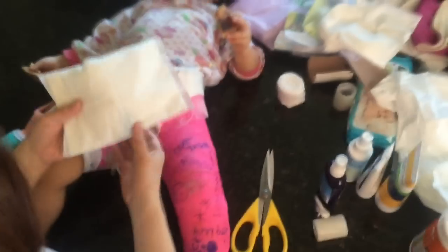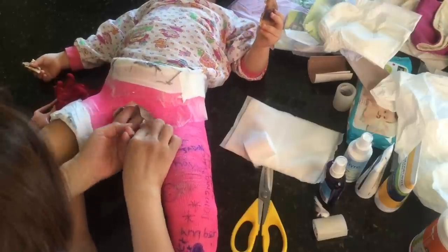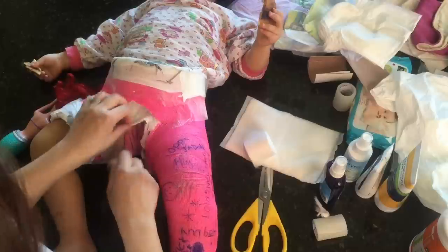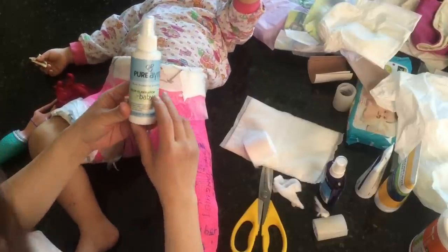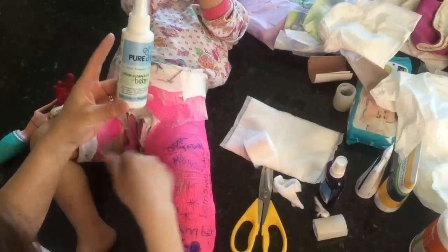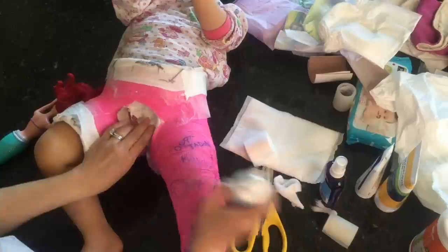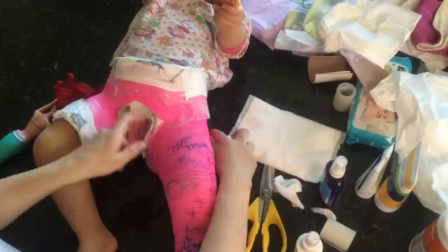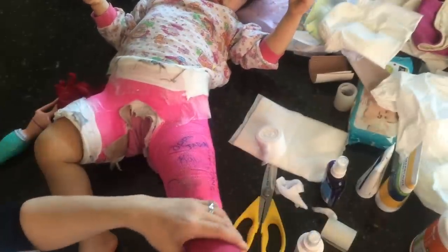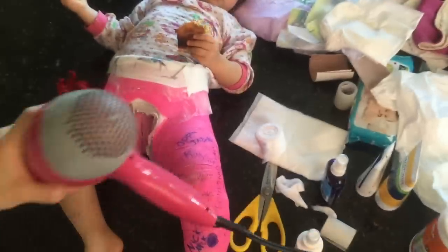You want to keep a little cushion in there, so you can use hospital padding material and rip it up to make a pad. First, you want to have everything dry. I got this spray — it says 'pure airy, odor eliminating for babies' — it's safe for babies and used for carpets, spills, and bedding. I covered her skin and sprayed it inside the cast.